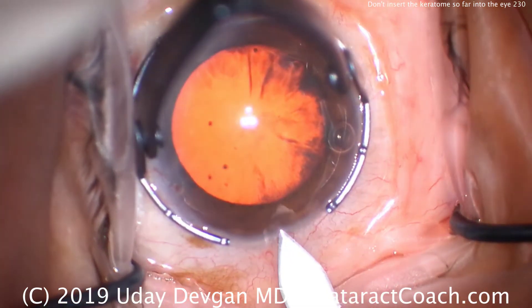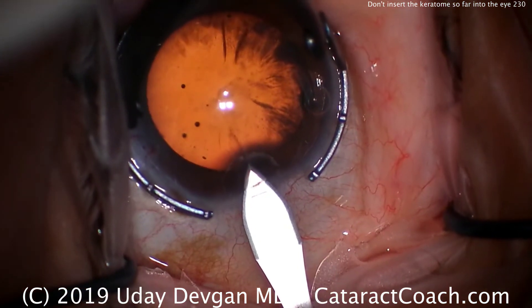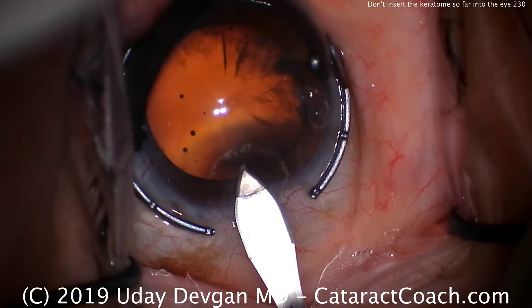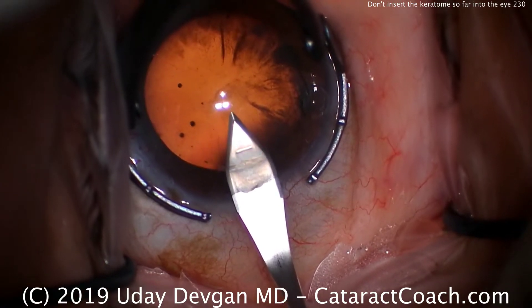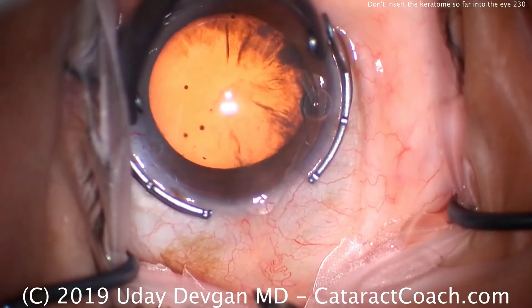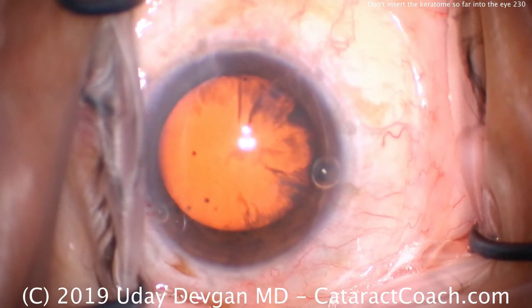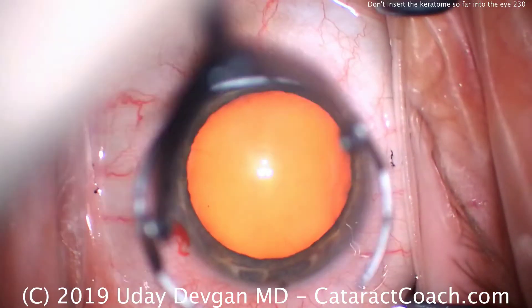Let's show a good incision. Here's the keratome — nice and slow, advanced, good architecture. When that line hits the epithelium, the tip hits Descemet's. And we only go till that part of the blade, and then out. There is no benefit of inserting the blade past the widest point. It just can damage inside the eye, such as the capsule.